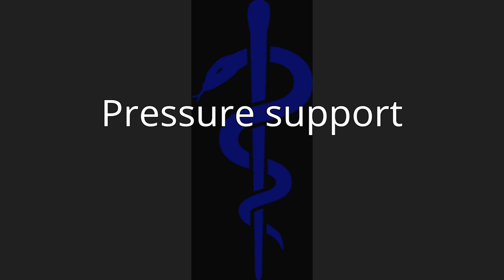Pressure support. Pressure support is a spontaneous mode of ventilation, also named pressure support ventilation (PSV). The patient initiates every breath, and the ventilator delivers support with the preset pressure value. With support from the ventilator, the patient also regulates their own respiratory rate and their tidal volume. In pressure support, the set inspiratory pressure support level is kept constant, and there is a decelerating flow. The patient triggers all breaths.